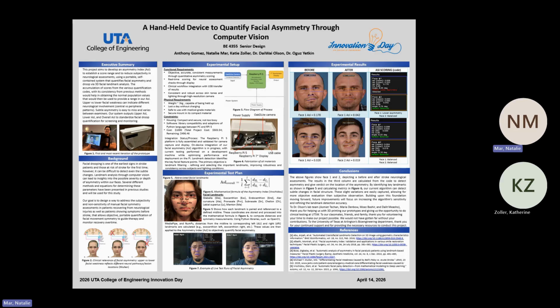Just to give a little background on this device, facial drooping is one of the earliest signs of people with stroke or Bell palsy, or anyone at risk of stroke for the first time. And it can be difficult to detect even the subtle changes within facial asymmetry.